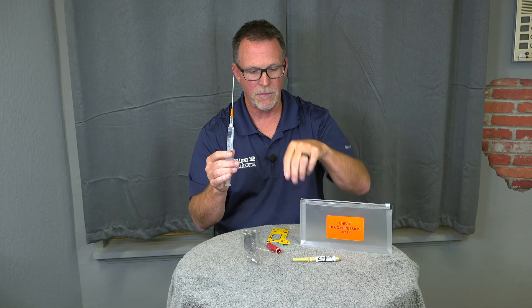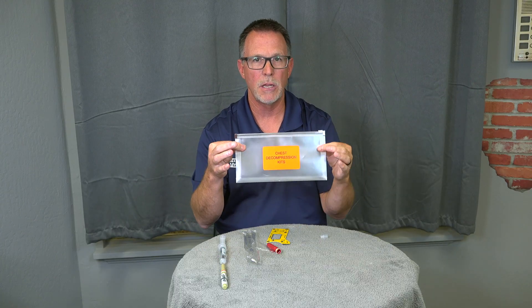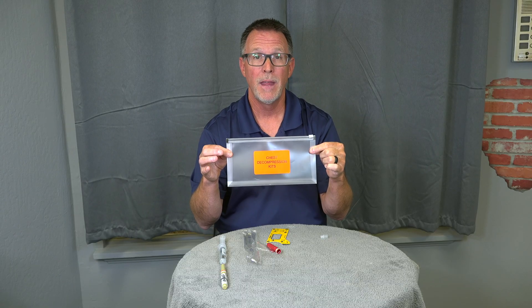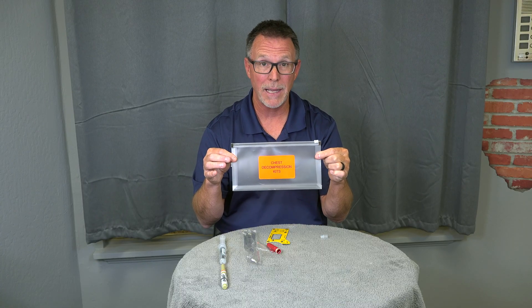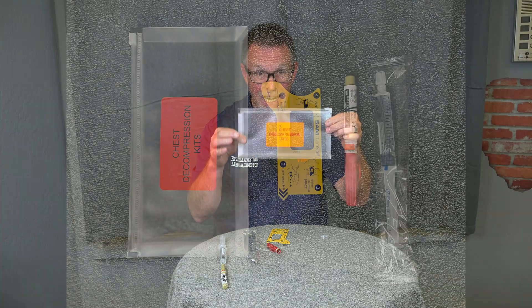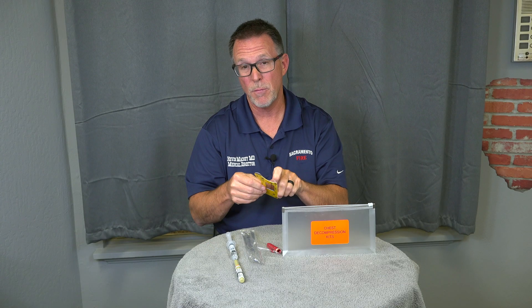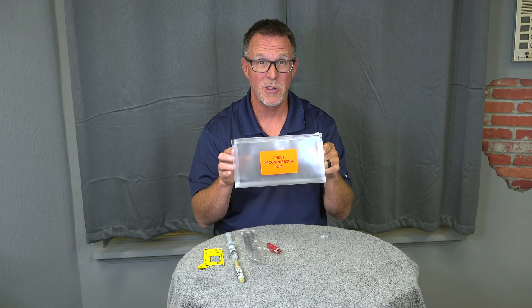So that was a lot of information, but just a quick recap. These kits are going to be located in all the ambulances in the trauma compartment above the bench seat. They will also be on all the engines, trucks, rescues, as well as hazmat — in the red bags, in the trauma bag, in the trauma part of the compartment. Inside is one Thoracite card, one needle, and one flush. If you have a traumatic arrest and need to use two needles, you'll need two kits, and we'll make sure you have enough.